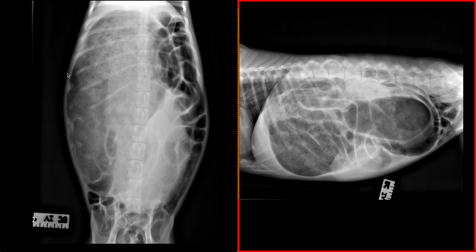We evaluate the gastric silhouette and identify that it is primarily in the right side of the abdominal space. It is gas dilated with heterogeneous soft tissue as well. The fundus is ventrally displaced, which is also inappropriate.